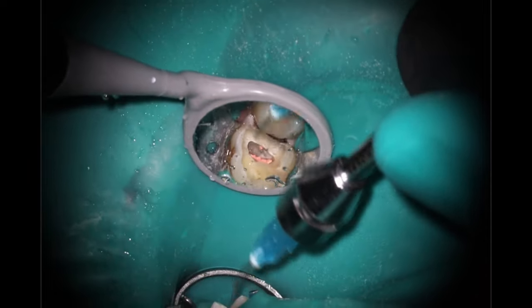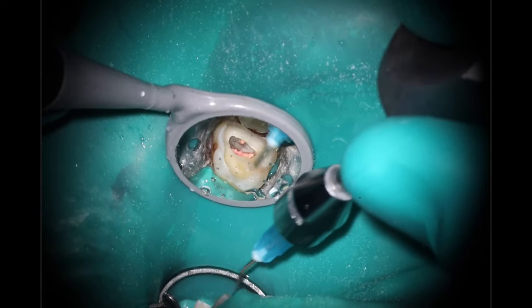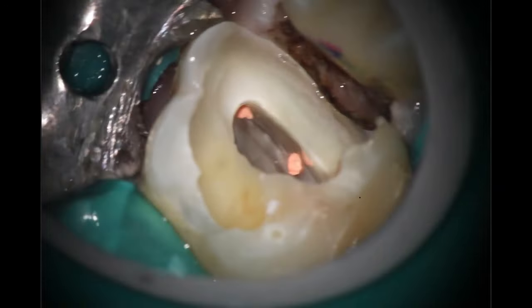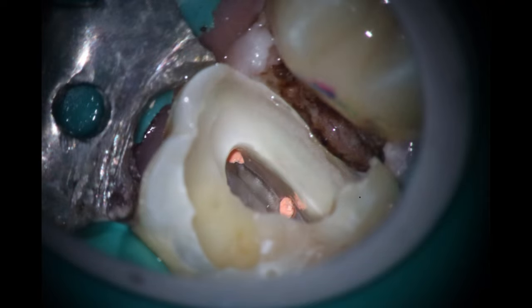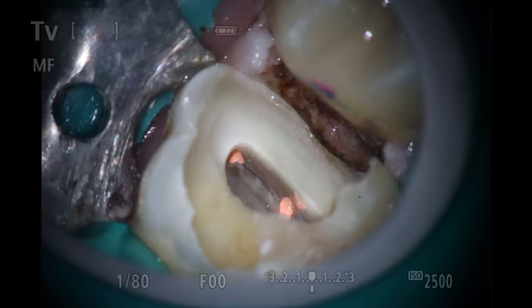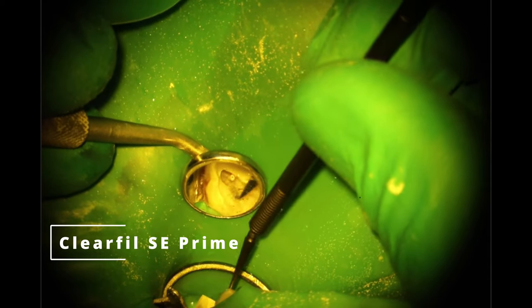We're going to be ready here for a picture. You'll notice I've swapped mirrors a third time here to get ready for the photo mirror. I'm drying. What are you doing during this time? I'm bringing down the curing lights and anything that I'll need to restore the tooth that I don't already have. You've already gotten the build-it-up — we already talked about what we're going to restore with. That's one of the key things from the doctor's standpoint: make sure you're communicating with your assistant what the plan is going to be. There's the still photo, looking nice and clean. We're going to start the bonding process. By this point she's already mixed everything, and the first thing we hand is the bond or the prime. Going in — during this point you're getting the bonding agent ready, correct? Correct.